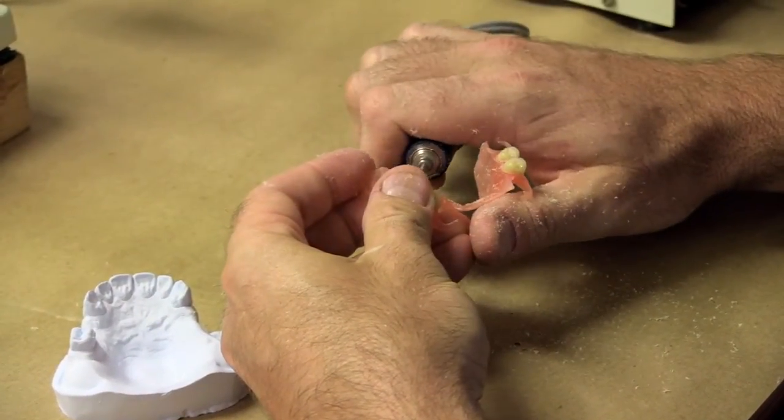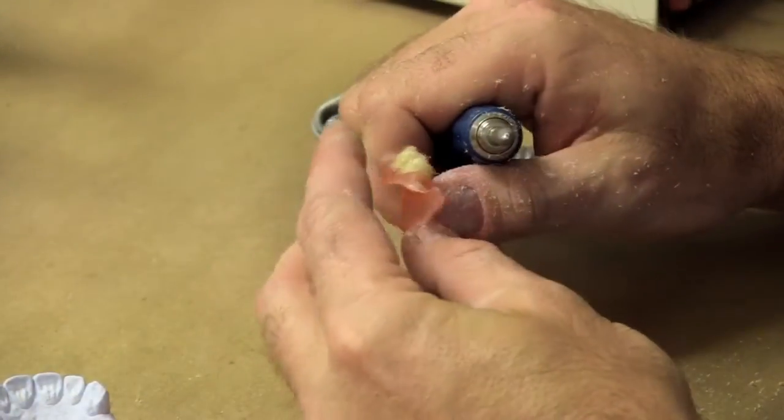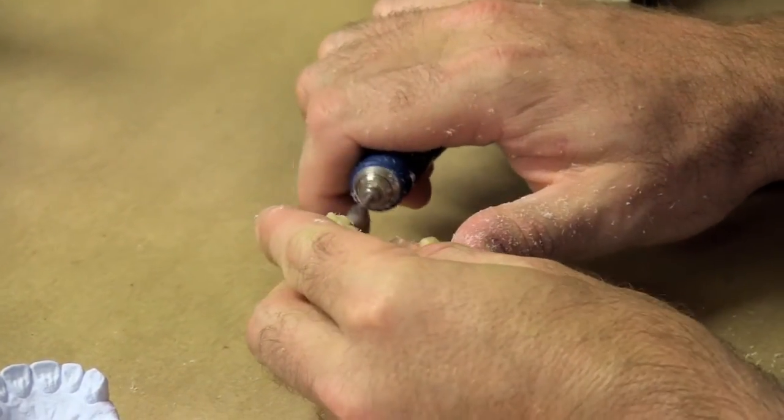As you can see here, Duraflex can be finished with regular carbide burrs. Once you are done finishing, it's now time to polish.